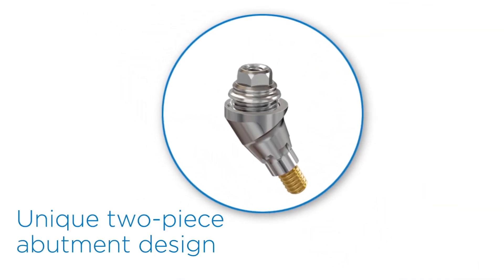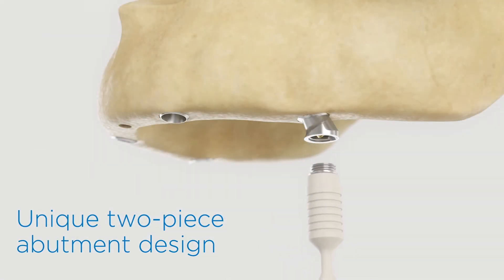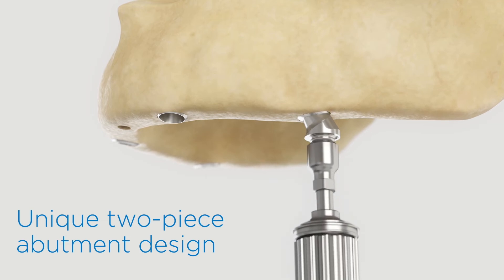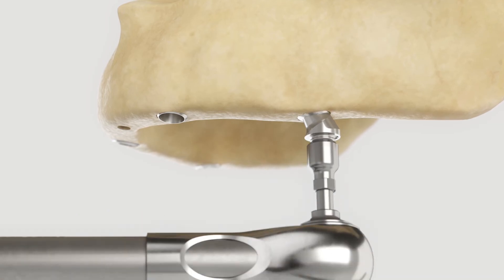And there's the unique two-piece abutment design that supports a stronger connection and a more secure placement. Avoid the need for costly remakes found with other solutions, because workarounds due to screws loosening over time should not be routine.